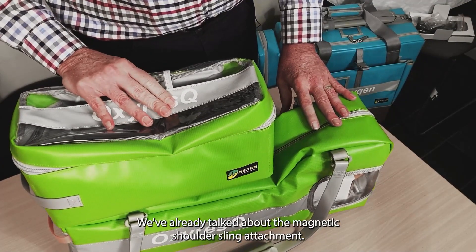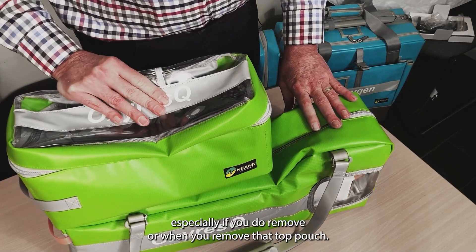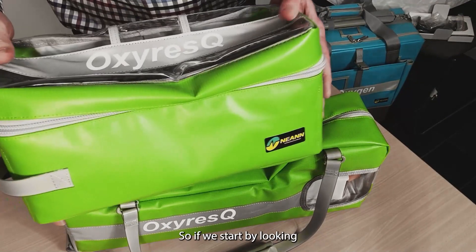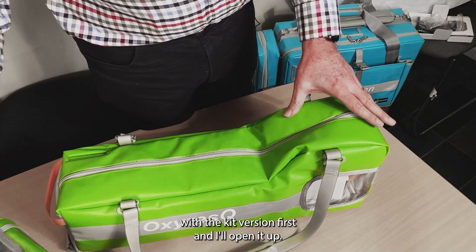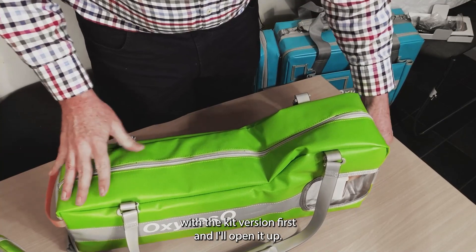We've already talked about the magnetic attachment, getting rid of Velcro, especially when you remove the top pouch. So let's start by looking through the bag — probably start with the kit version first and open it up.